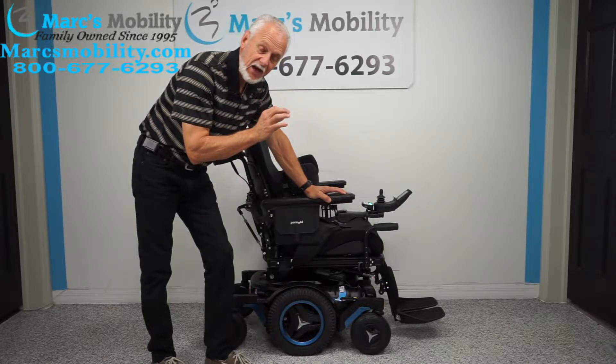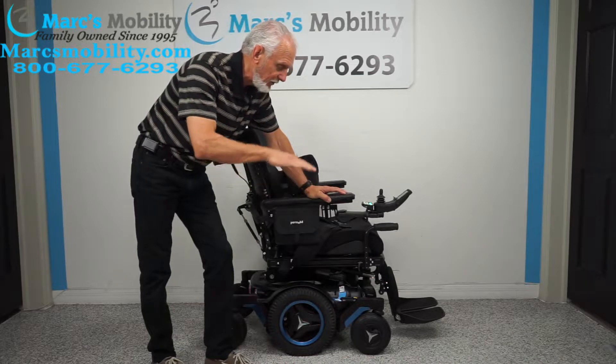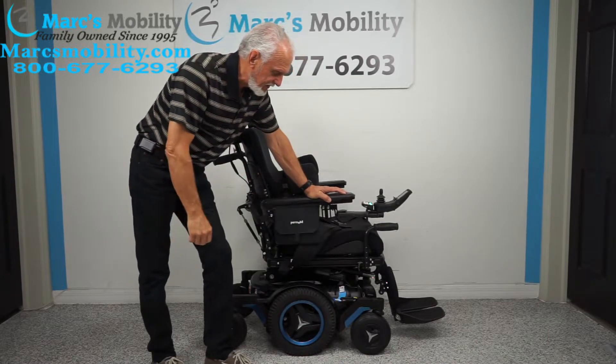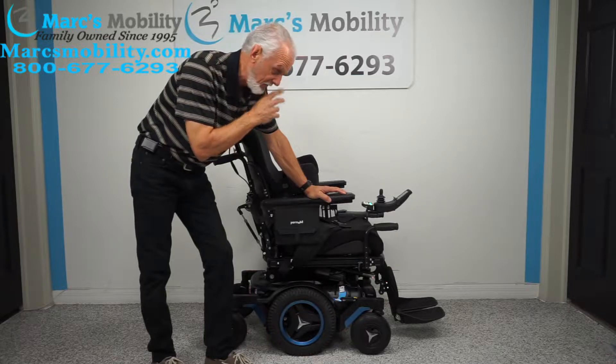The M5 goes seven and a half miles an hour — it has high-speed motors. The seat lift goes up to 14 inches, not 12 but 14 inches high, and it has a top speed of seven and a half miles per hour. These are the two things that most chairs don't have.